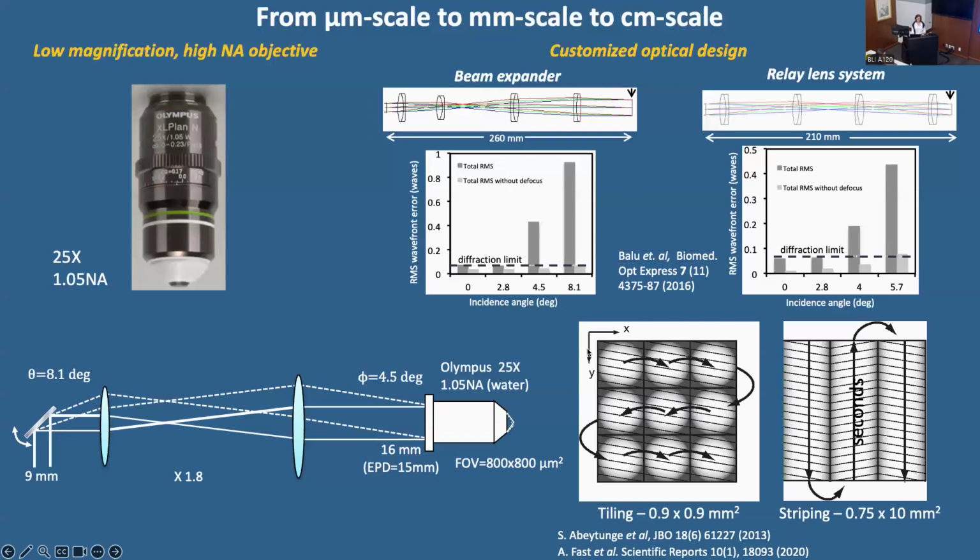So when we image more than, let's say, 3 by 3, I think our threshold was 4 by 4 millimeters squared, if you want to go beyond that, we switch to this mechanism where we use what we call strip mosaic. We park one of the mirrors and we scan with a single mirror and the stage. So we pull the skin under the microscope over a long distance; we have high-speed stages that can do that. So that's a summary of the design that you need to consider when you put this together.